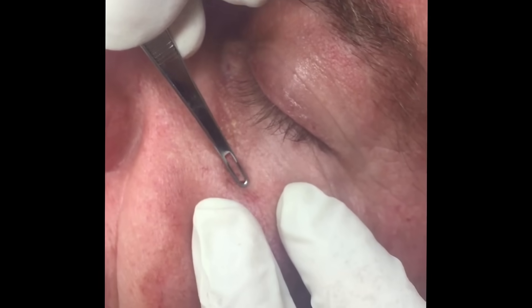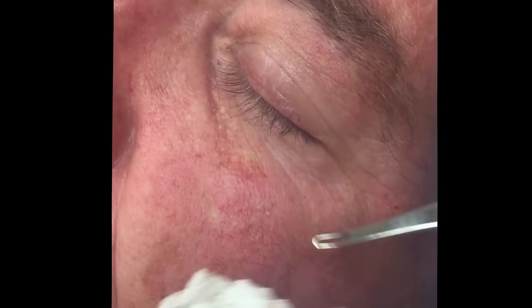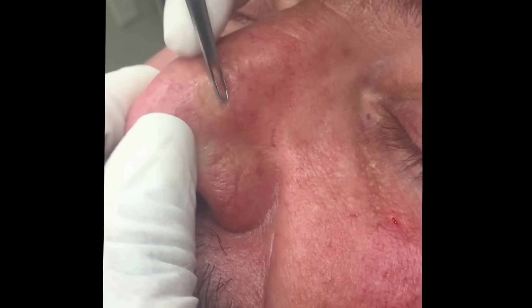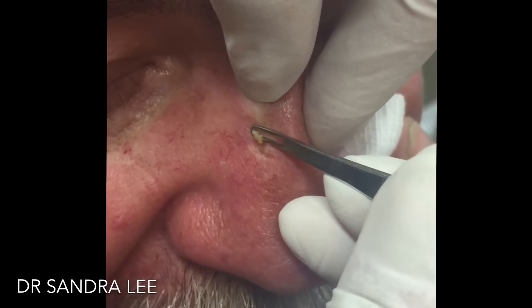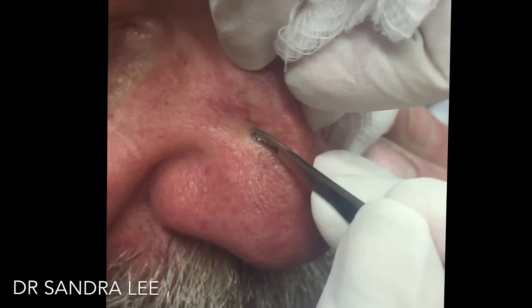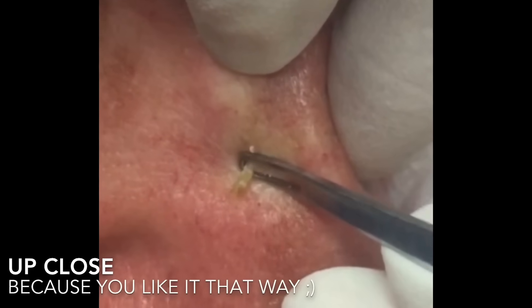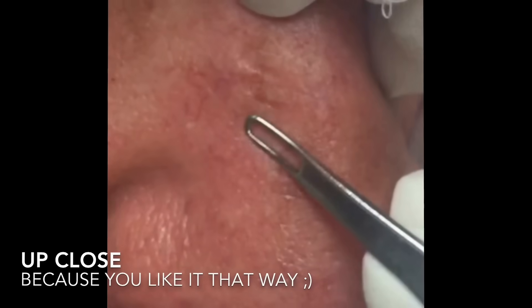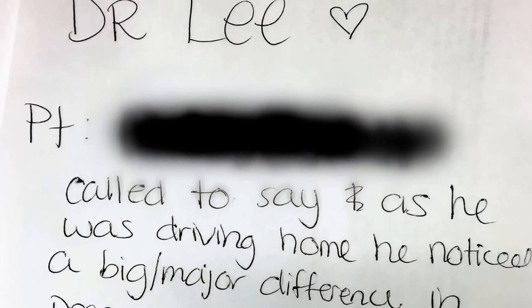We're gonna just put a little brush and see if that one will squeeze out. Good. That one looks good — your nose is pretty good, huh? Let me see. I don't think there's gonna be anything except for the little ones — nope, your nose is really good. Let's see if it can come out now. There we go, that was a good one. Goodbye!